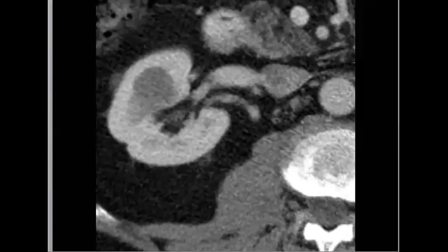Okay, I see many suggestions, which is good, but how can you start? I mean, any focal lesion in the kidney, and when it is indeterminate, it will be what until proved otherwise?